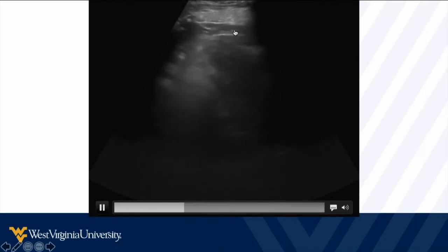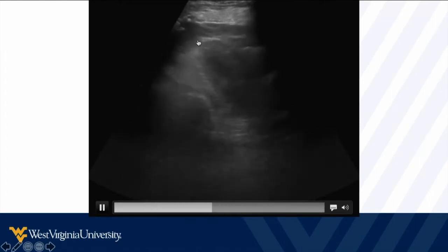And the last one, again, beating it to death. This one keeps mostly the same shape, a little differentiation, but it does not wrap circumferentially. It's mostly a homogeneous, kind of regular flecks of gray. This is another fat pad.